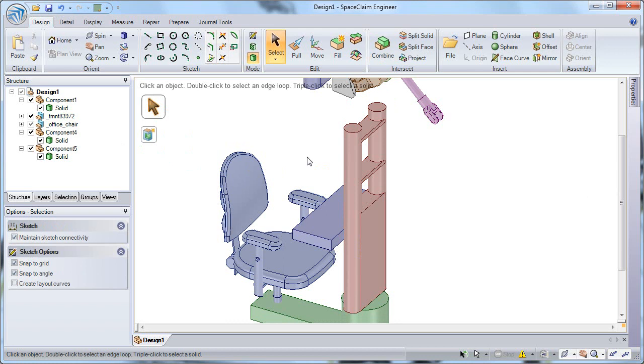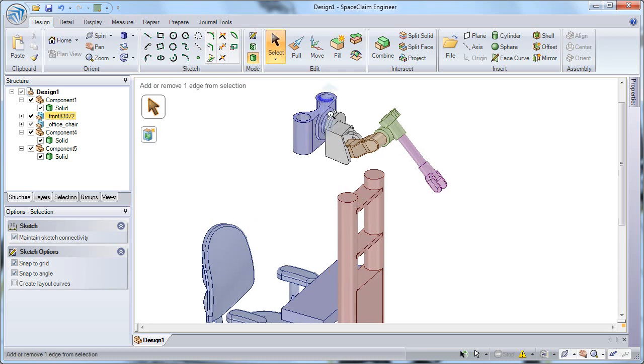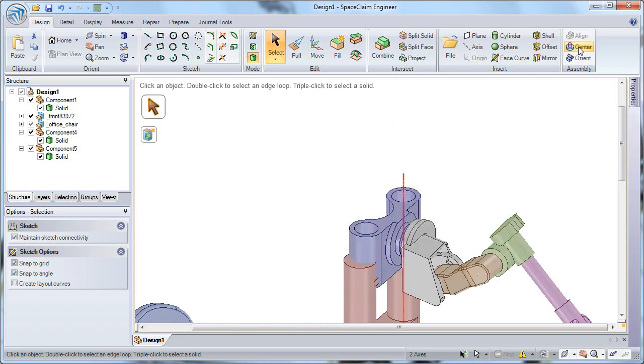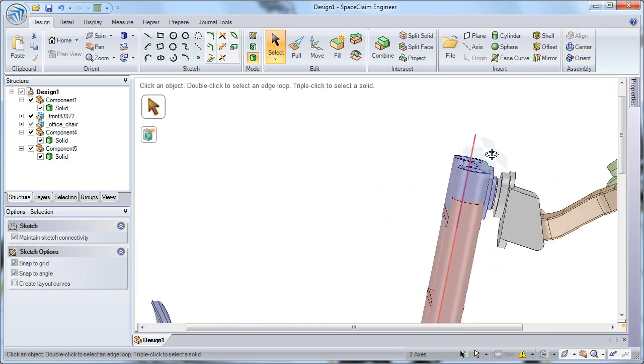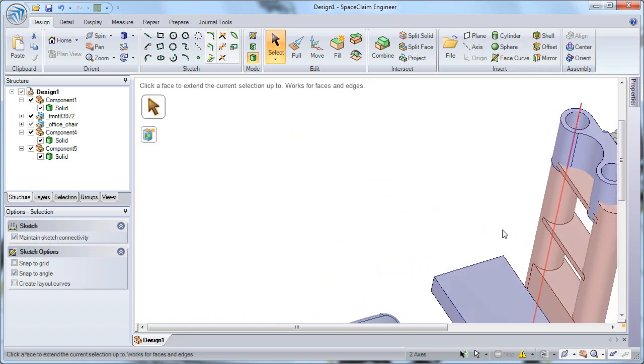So now let's assemble that arm that I imported from Pro Engineer. So I'd like to specify that assembly constraint by selecting on the two axes through the arm and through the mount, and choosing my Center command from the assembly group on my ribbon. You notice that it'll assemble those two constraints together, moving the first selection to meet up with the second selection.